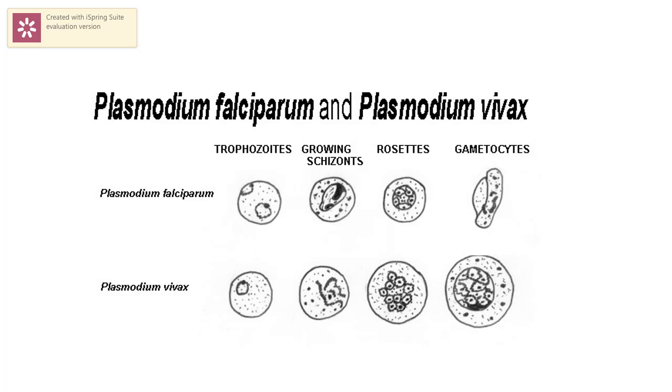I hope you have understood this practical, and now the only thing you need to do is to observe the permanent slide under the microscope. When you are back at college, you can do that activity.